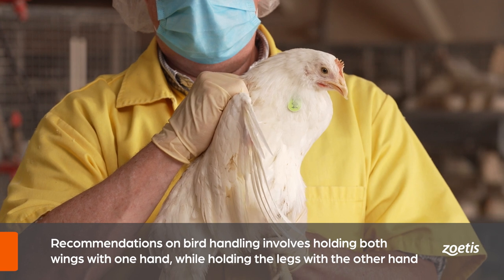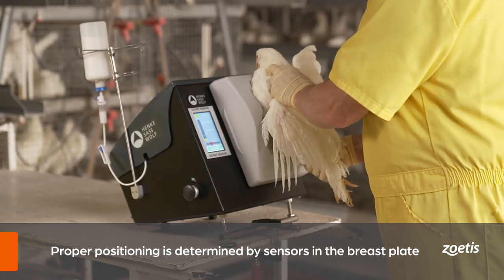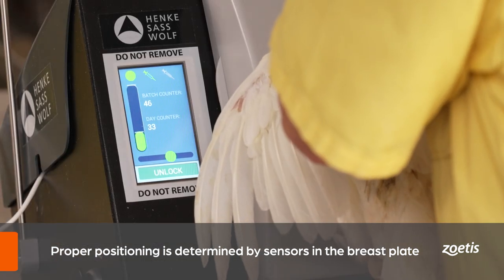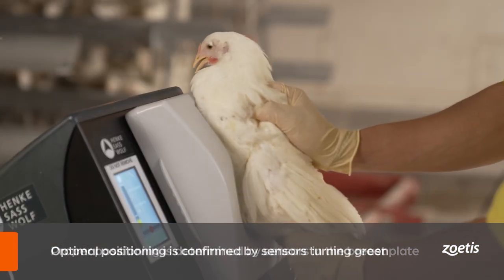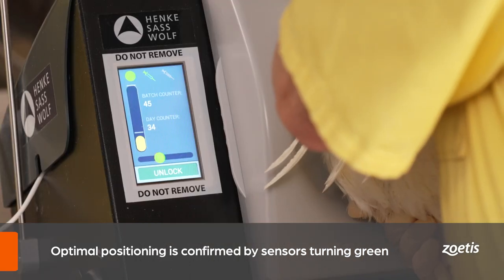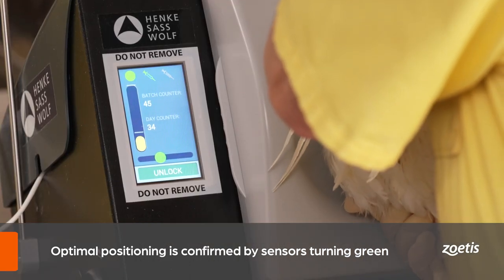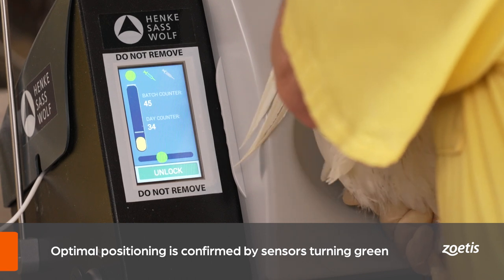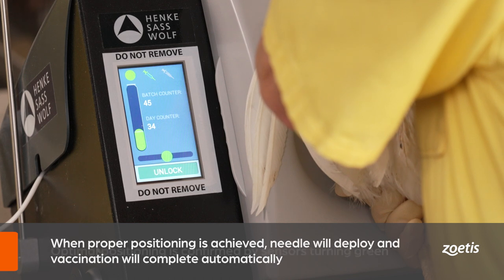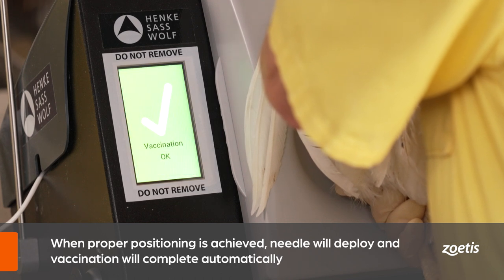The operator will then position the bird on the breastplate, where sensors will indicate whether the bird is positioned properly. Even pressure should be applied to the back of the bird until the sensor indicates proper positioning. This is indicated by all three sensors turning green at the same time. Once the bird is positioned correctly, the needle will deploy and vaccination will complete, indicated by the 'vaccination okay' message.